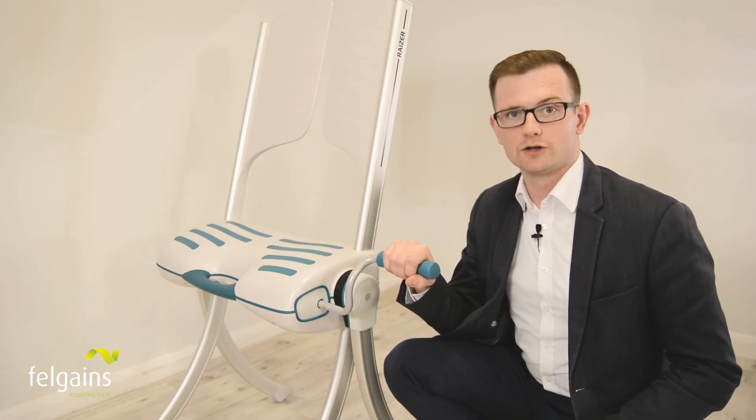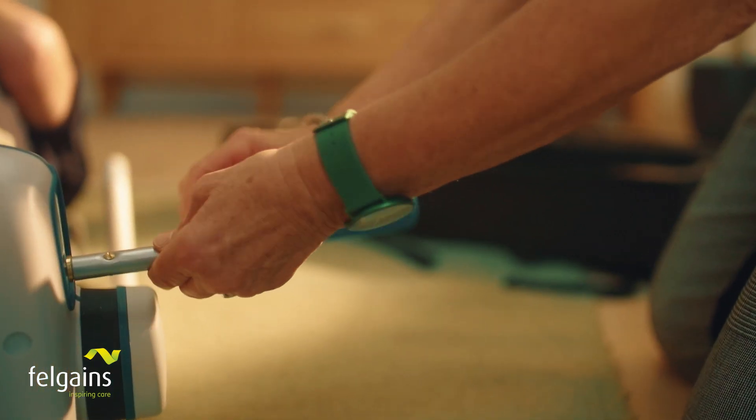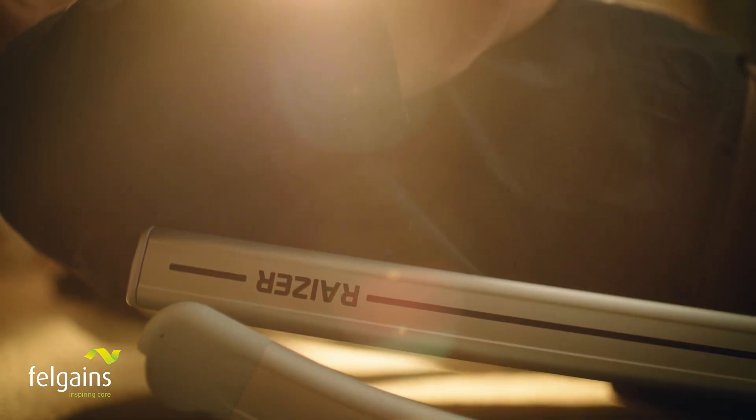The Raizer M's manual crank operation is still very easy to use. However, it does take a bit more physical effort. If you're the kind of person that's mobile and strong enough to do the hoovering, you should be able to operate the Raizer M.